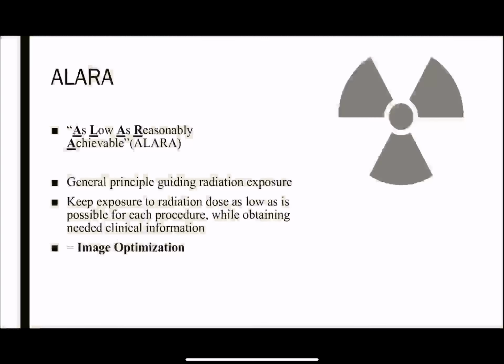So we all know what ALARA is. It is known as As Low As Reasonably Achievable. So this means that we have to keep the minimum exposure factors while maintaining image quality.